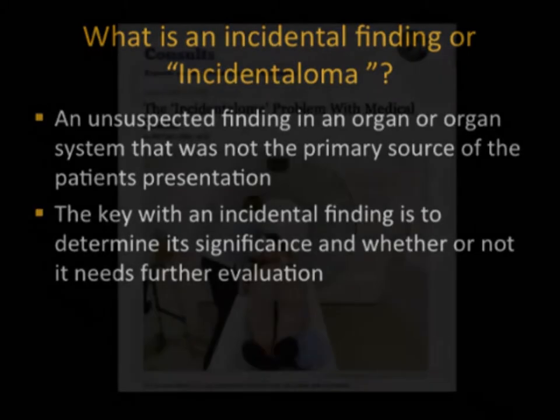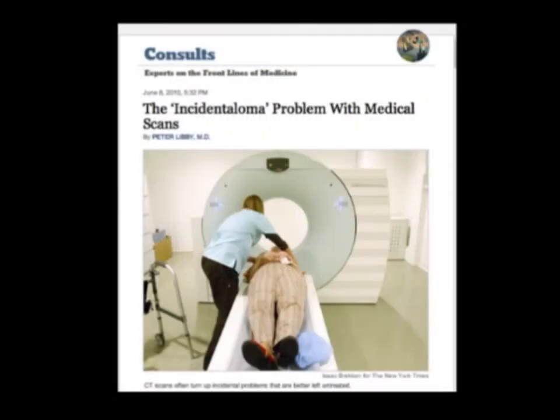Even in journals like the New York Times, the incidentaloma problem is often discussed. CT scans often turn up incidental problems that are better left untreated. Again, we also know that, depending on the article, 3 to 5 percent or maybe a touch higher of incidental findings will indeed be important. We detect cancers and many other things that will change patient management, but it's very critical that we have some sort of strategy in dealing with these.